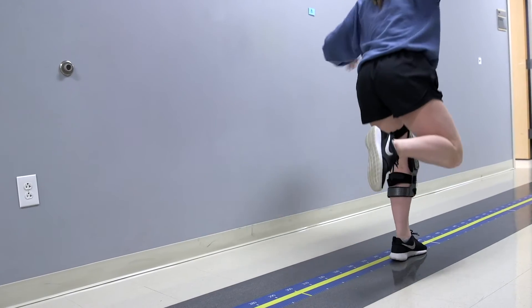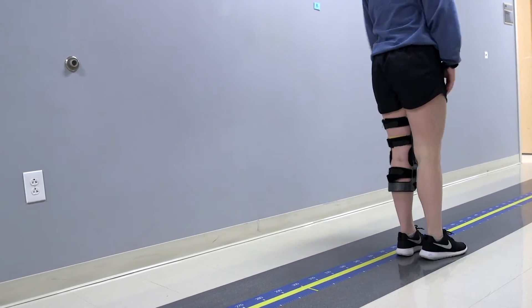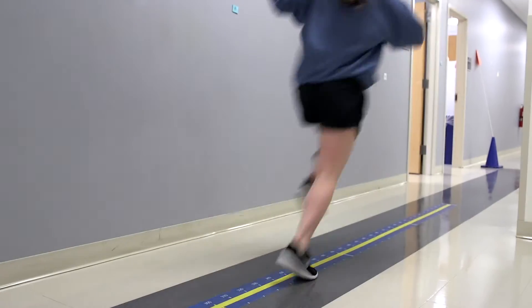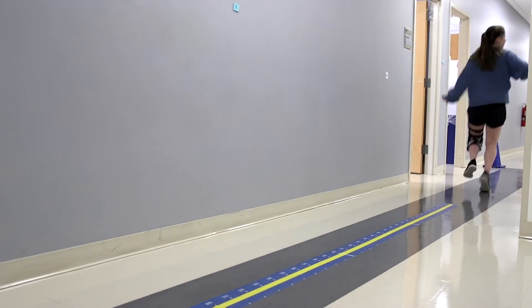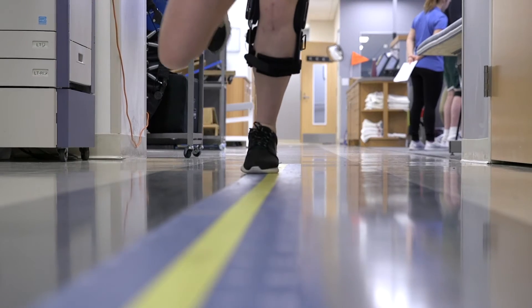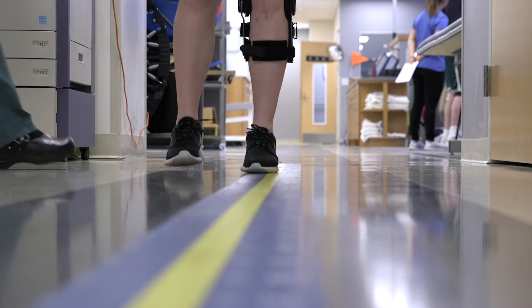In our rehabilitation portion of the study, we provide them feedback about their landing mechanics and things they might be able to do better, so that they would reduce their risk for a second injury — which is of course a major problem in our area of study.